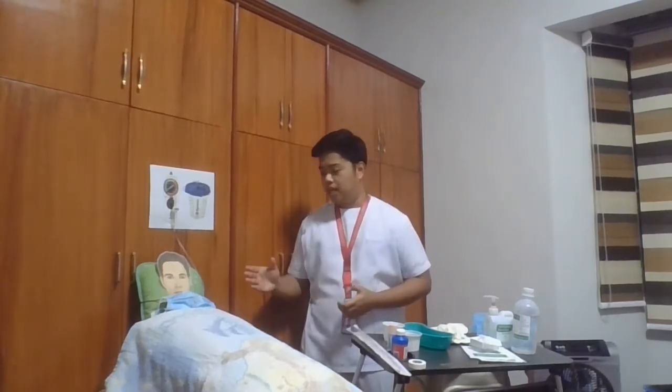Good day. My name is Mars Miguel Sivis-Monte and I am a third-year nursing student from San Veda University. Today I will demonstrate providing tracheostomy care and open system suctioning.